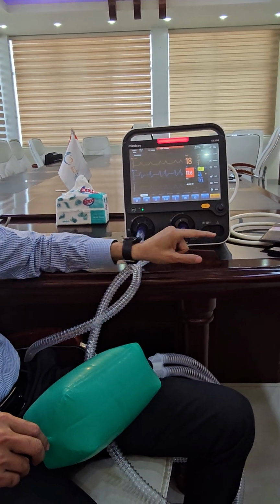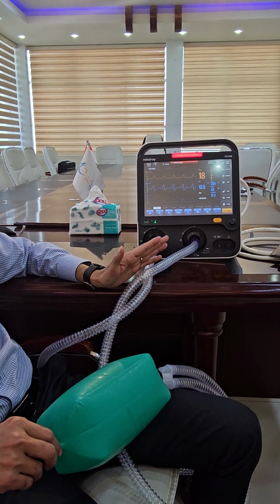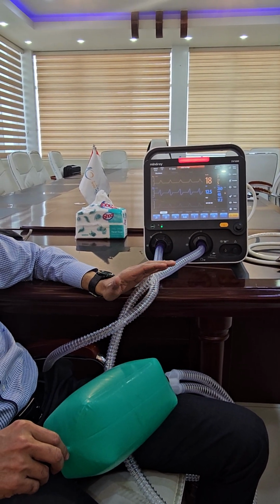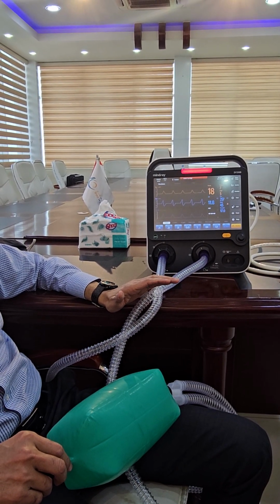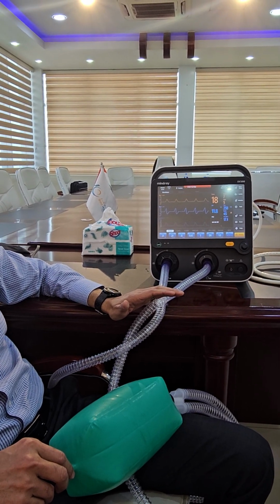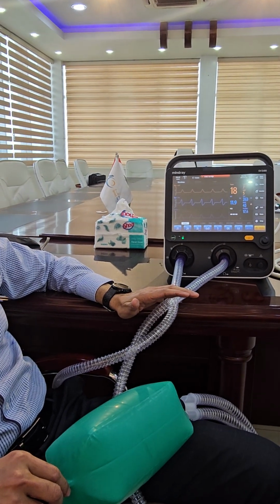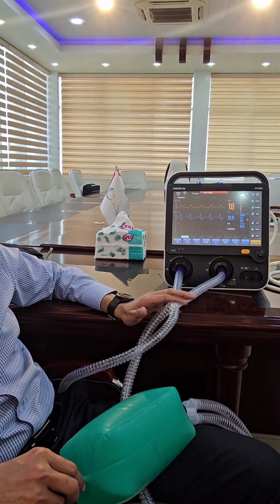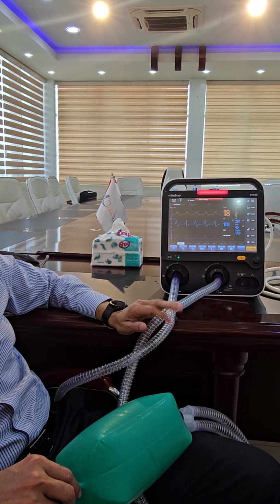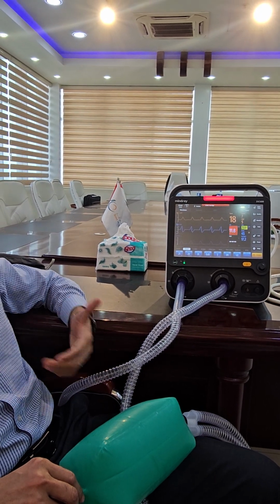So we said the inspiration is 22.75. Plus 22.75. Just write it. 22.75 plus 22.75. So this is how much time? 45.5. This is the time for inhalation and exhalation. The remaining time is for pauses, so the baby will be relieved. He can pause. He can stop breathing.